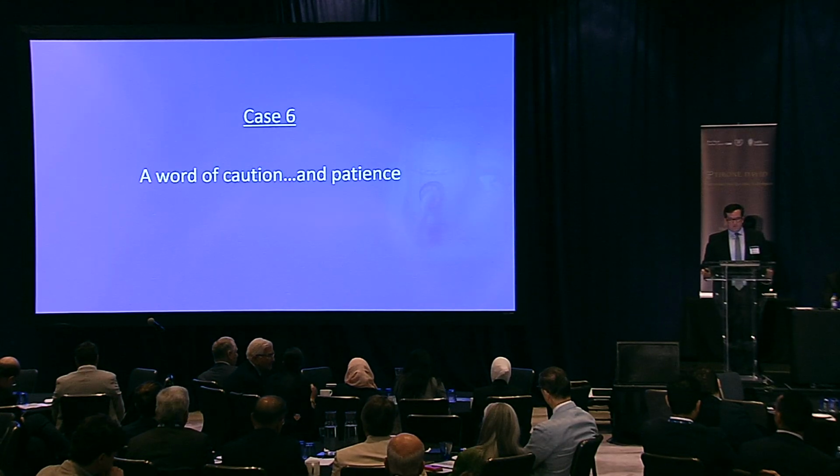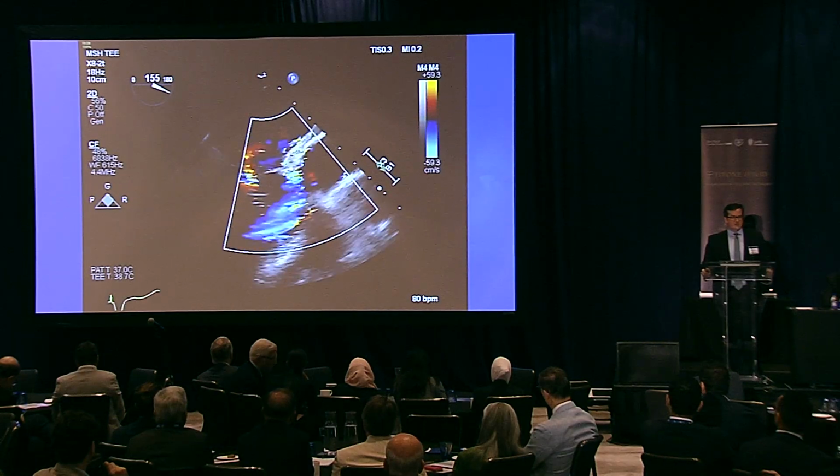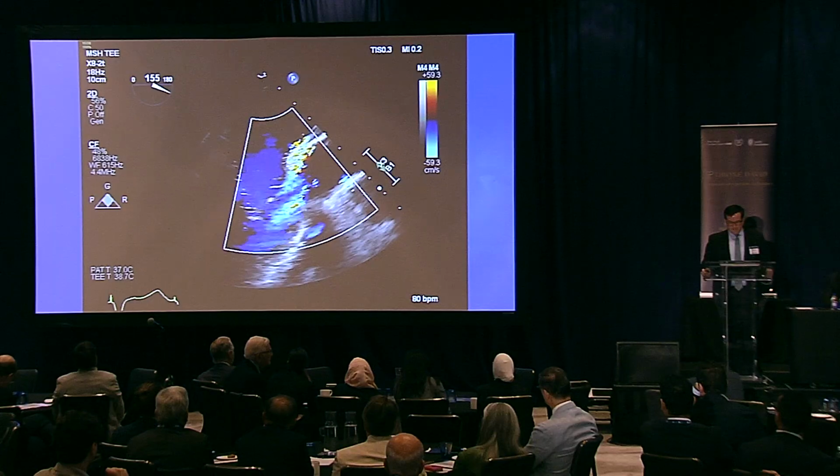So this is actually from one of our Ross courses. This is our live case. We took the clamp off, and this is what it looked like. And our stomachs all kind of sank. I think the audience was a little bit surprised too.